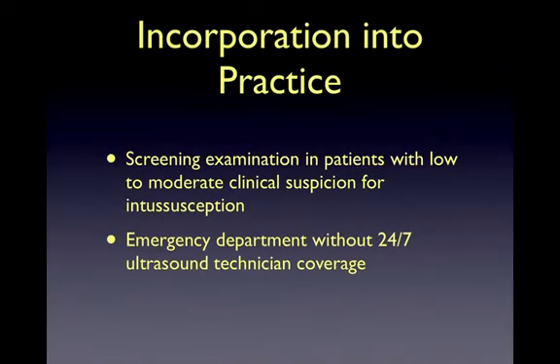Once the operator becomes comfortable using ultrasound to diagnose pediatric intussusception, it can be used as a screening examination in patients with low to moderate clinical suspicion for intussusception. And this is especially valuable in emergency departments without 24/7 ultrasound technician coverage.